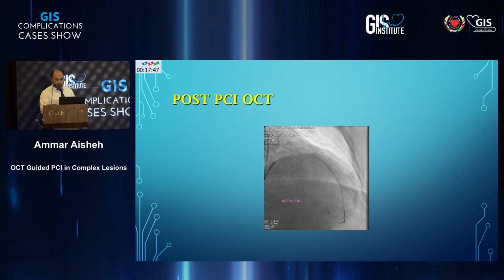And as we see here, especially in the mid and the distal segment of the stent, there was a significant fibrotic lesion. Here we can recognize.